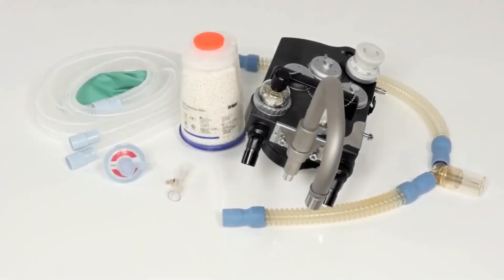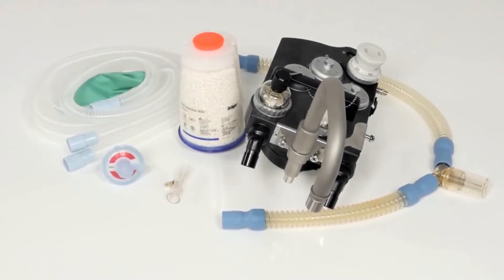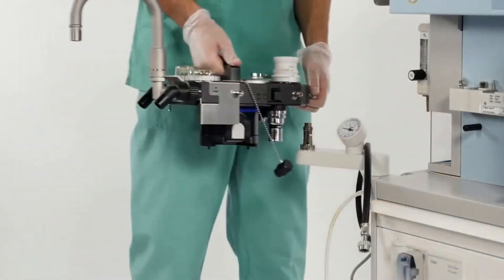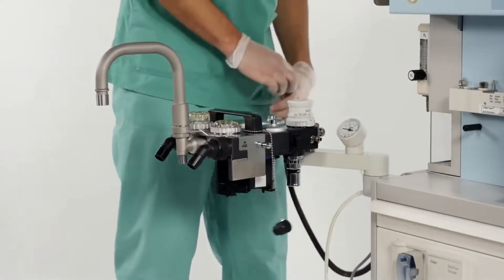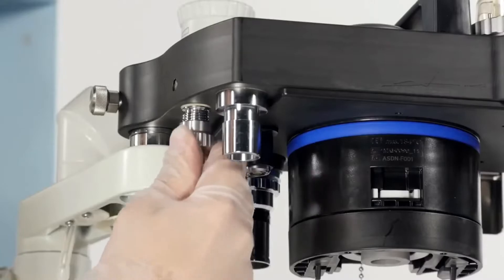For preparation of the breathing system, make sure that all parts are present. Fit the compact breathing system onto the mount located on the mounting arm. Connect the fresh gas hose from the Fabius to the compact breathing system.